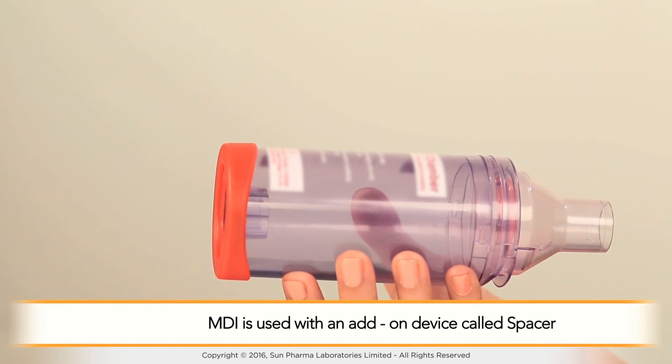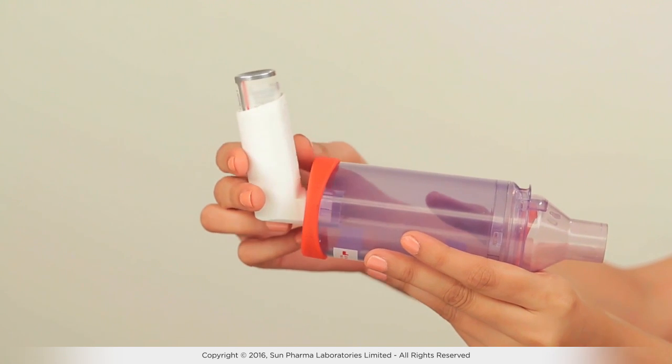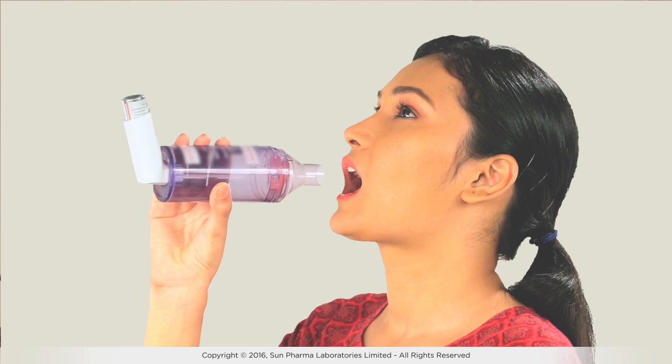Sometimes the MDI inhaler is used with an add-on device called a spacer. A spacer is a chamber that can be attached to a metered dose inhaler. It adds space in the form of a tube or chamber between the canister of medication and the patient's mouth, allowing the patient to inhale the medication by breathing in slowly and deeply as per convenience.